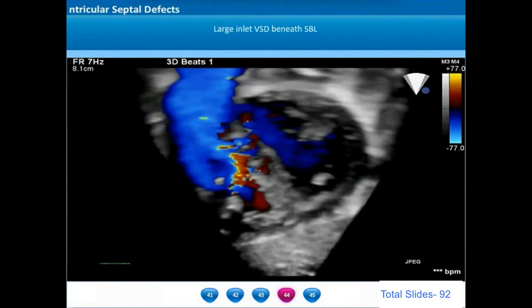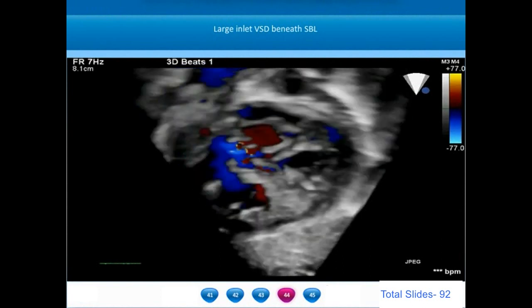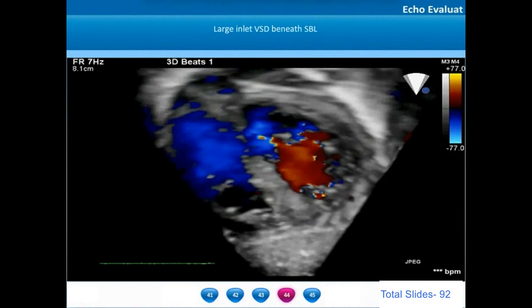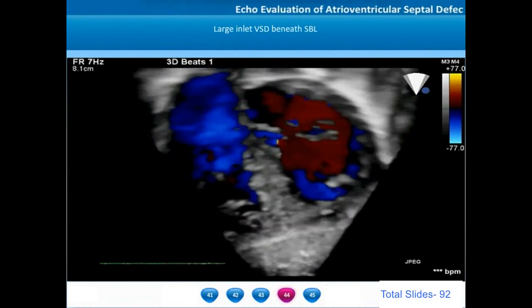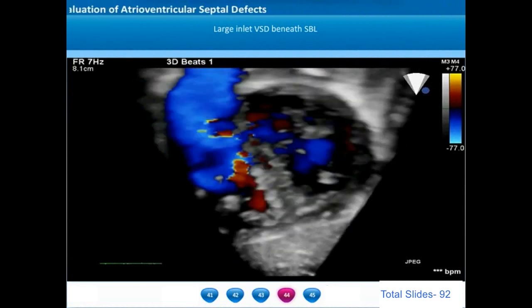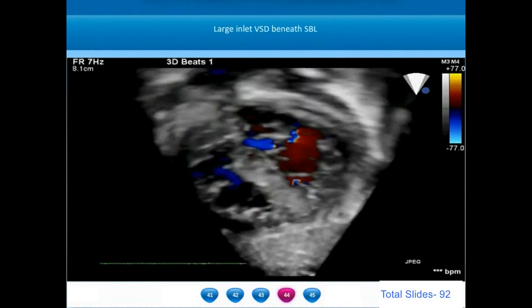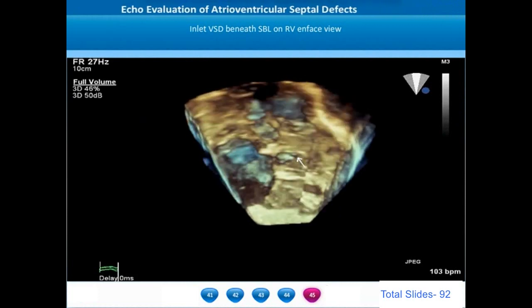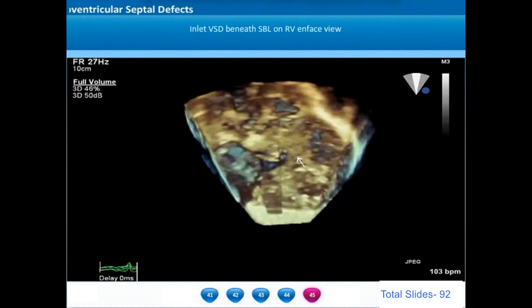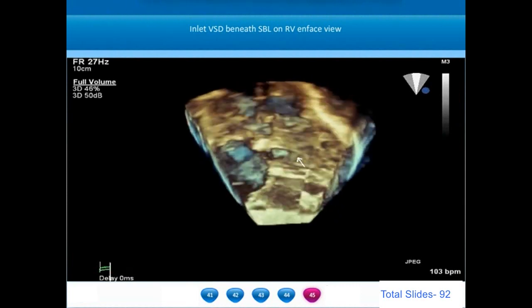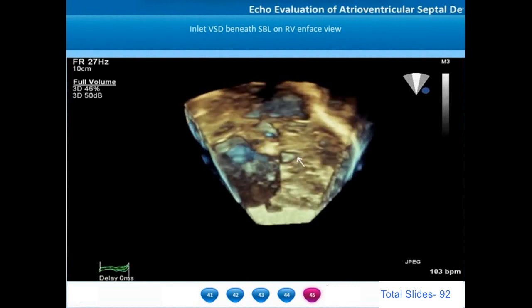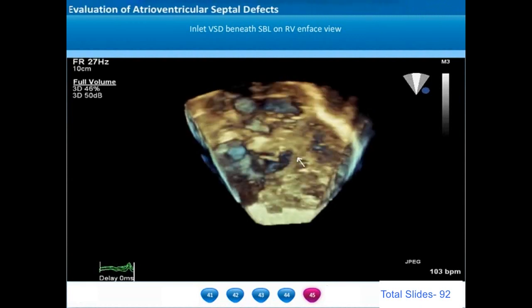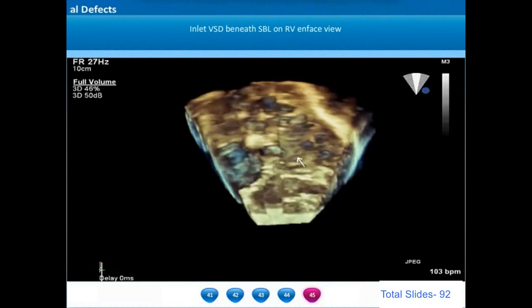On three-dimensional echocardiogram ventricular view, we can see color flows beneath the superior bridging leaflet through a large inlet VSD. Intermediate type AV septal defects are associated with moderate to large-sized VSDs. On the subcostal ventricular 3D view, on the RV en-face view after cropping off the right ventricular anterior free wall, the inlet VSD in this example is primarily confined below the superior bridging leaflet. All the cordal tissues from the bridging leaflet have closed off the inlet VSD beneath the inferior bridging leaflet.